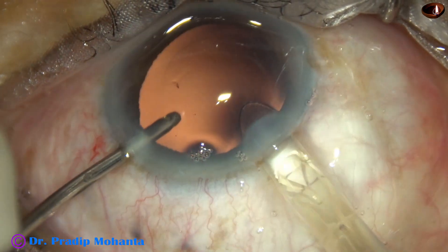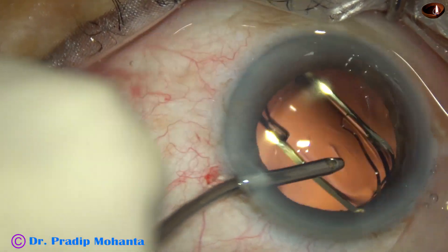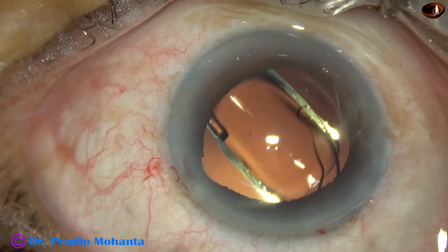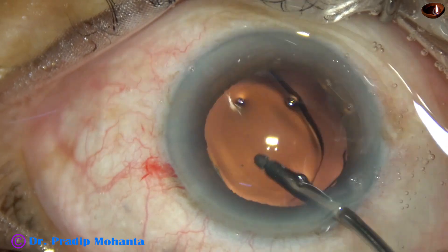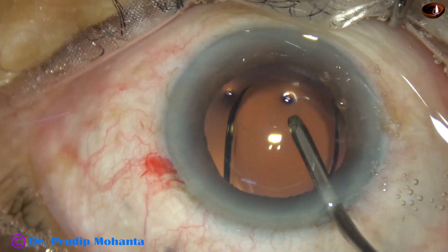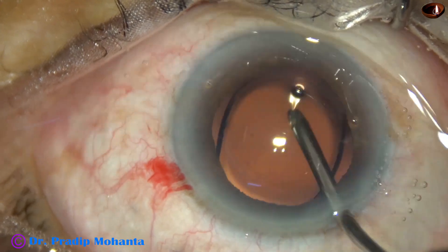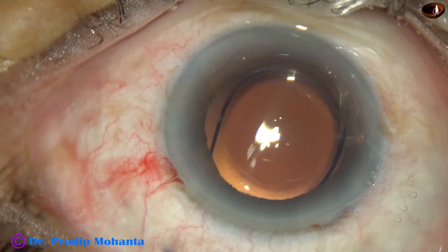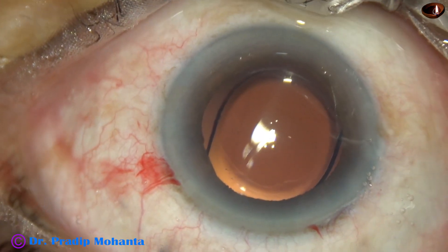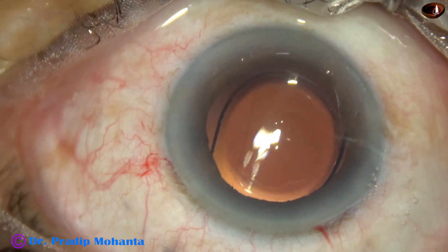This is hydro-implantation of a single-piece hydrophobic monofocal intraocular lens. The lens goes into the capsular bag, and the haptics take shelter at the equatorial part of the capsular bag. The capsular bag is irrigated nicely by the irrigating cannula, and then a bit of moxifloxacin is injected.